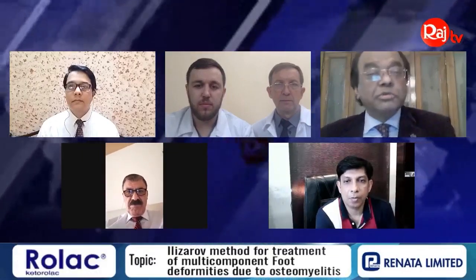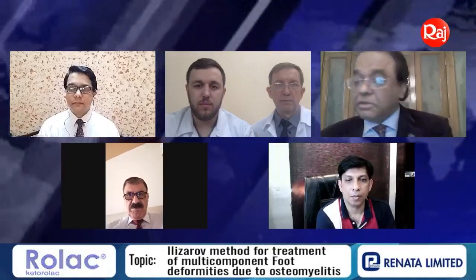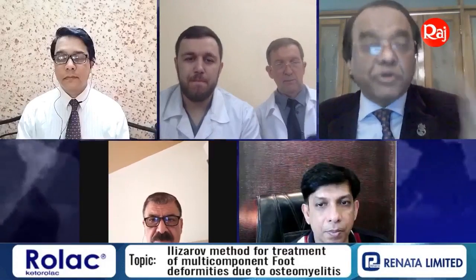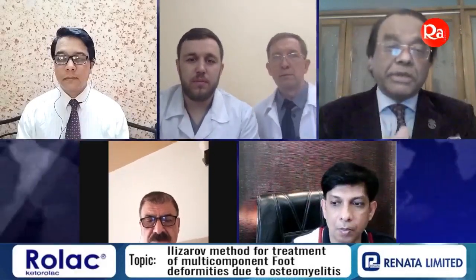Dermatension, you have shown it fantastically. And the word sequestronecrectomy is commonly used in the Russian Kurgan Center. In the Western world, they don't use that term, but I use this term all the time. They always say debridement, whatever. The terminology is very good: achillotomy, plantarotomy, sequestronecrectomy. The terminologies that you are using, and how to treat infection with the different components in the foot: equinus, cavus, varus, you can correct simultaneously.